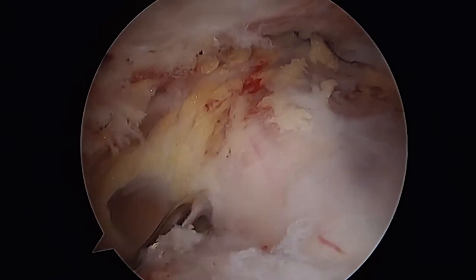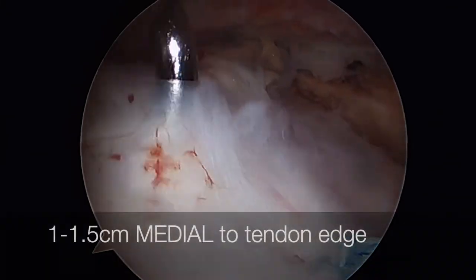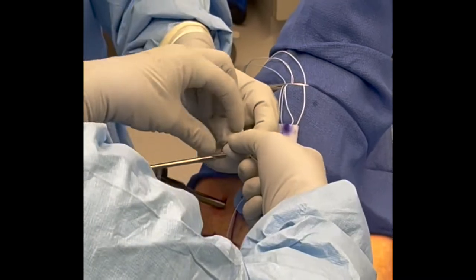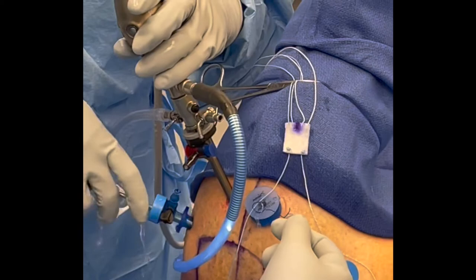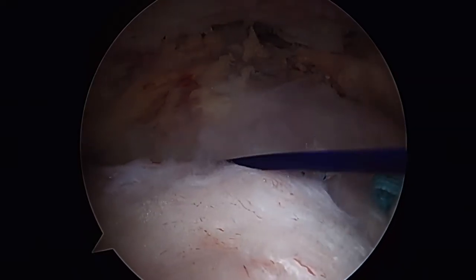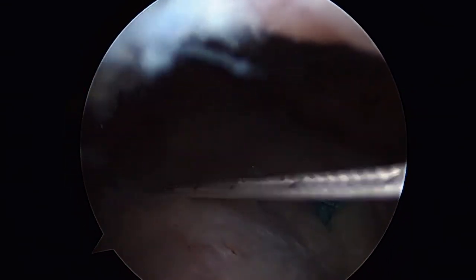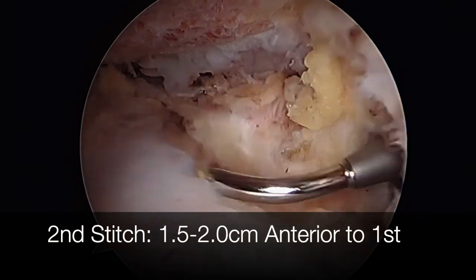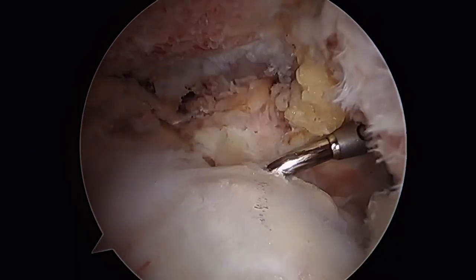Using through-and-through suture hook suturing technique, the shuttle is passed through the cuff, posterior and medial to the tendon edge. The shuttle is passed out the anterolateral portal, tied to the posterior stick limb, and then used to shuttle the stick limb down through and across the rotator cuff. Then suturing from anteriorly, we'll pass a second through-and-through shuttle, anterior and medial to the tendon edge, using the exact same technique.